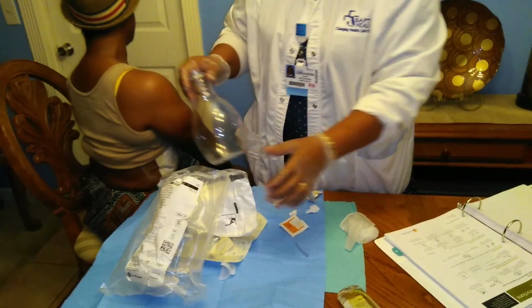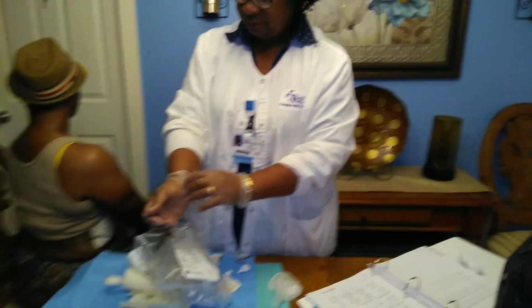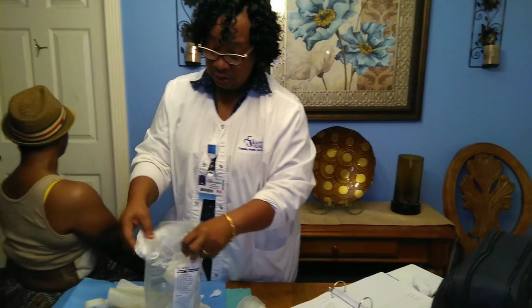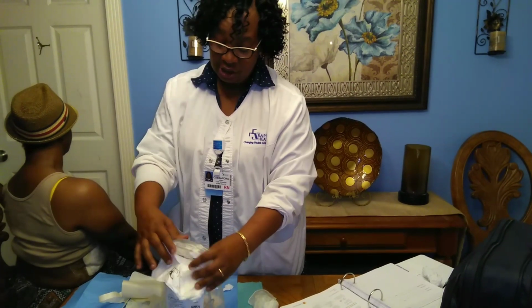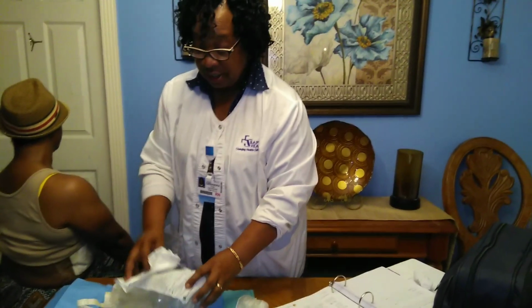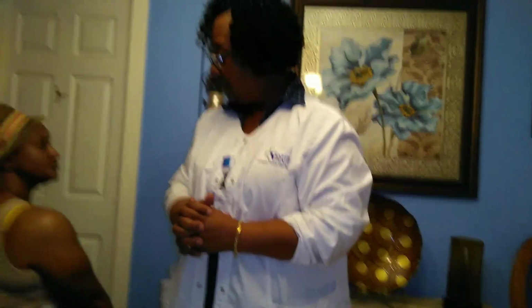Then I take this back and put it in the bag completely. Take off my gloves, put it all in the bag. And I usually have a separate bag to put this in, and then I double bag it and put it inside the trash. Okay. And again, I always document what my drainage looked like, how much it was, how the patient tolerated it. And I make sure the patient is okay before I leave.